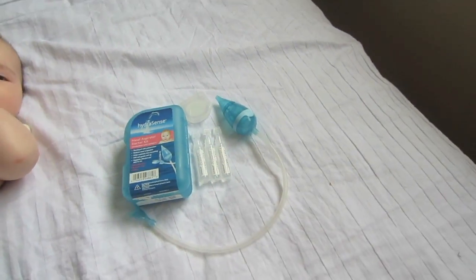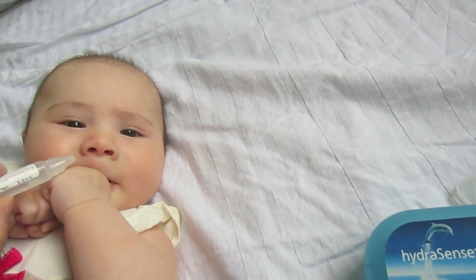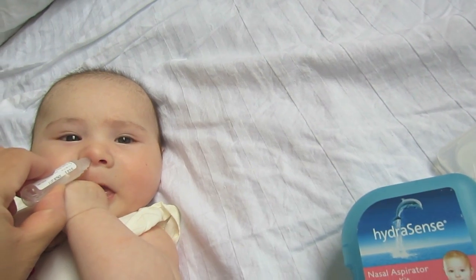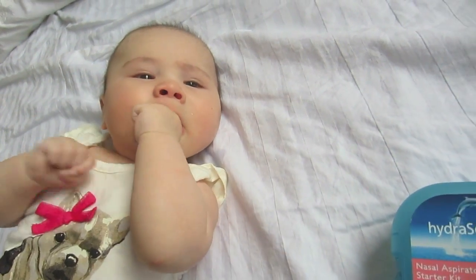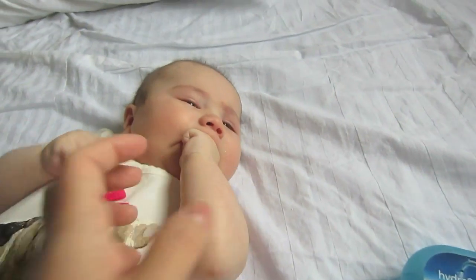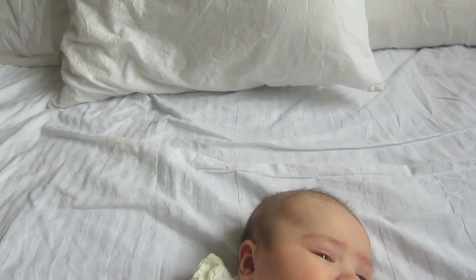The first thing you do is open a pack of saline and just squirt it into each nostril. This will soften the mucus. Sometimes it might get into her throat and she'll swallow it — that's fine because it's saline.